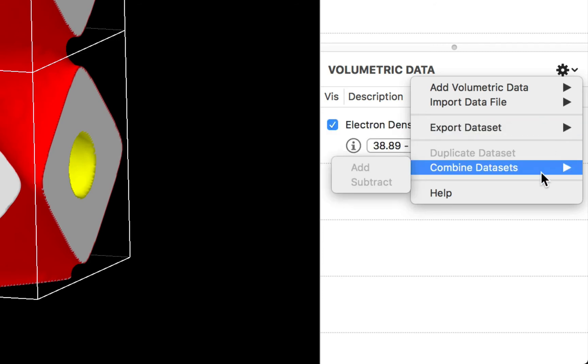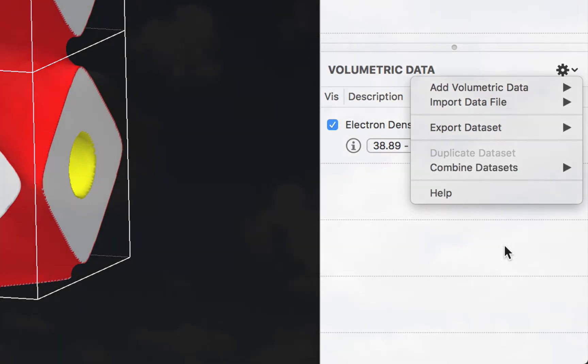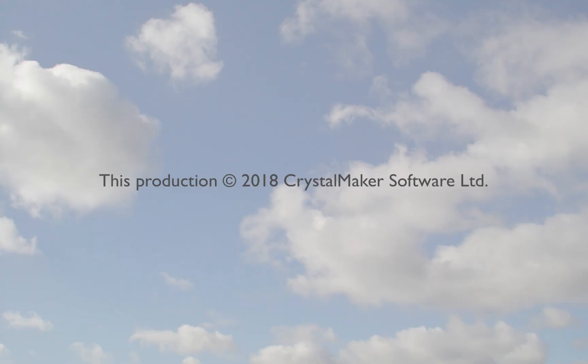We also have commands to duplicate and combine data sets to add or subtract them.